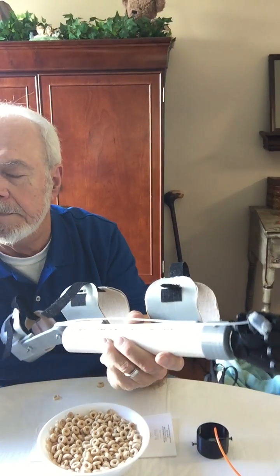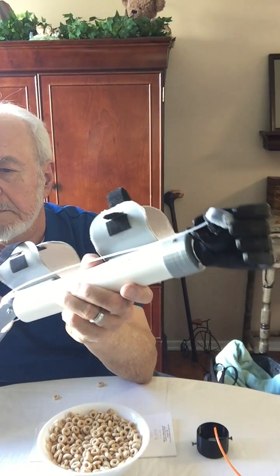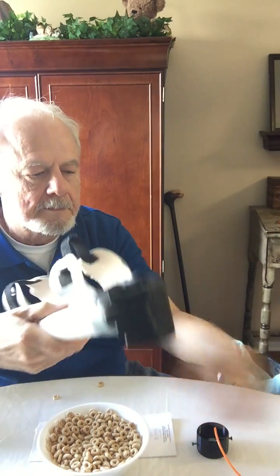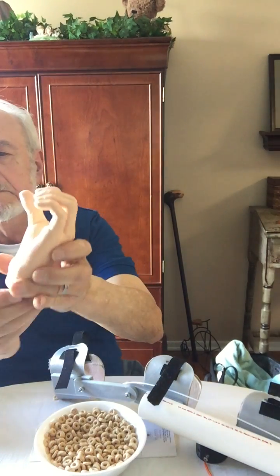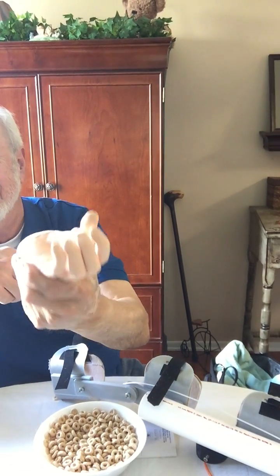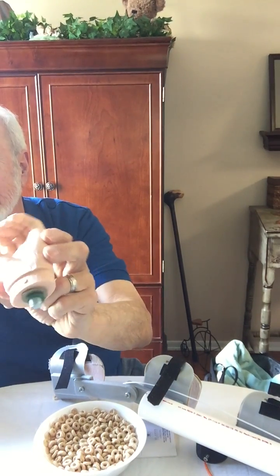I would like to point out that, of course, what you're showing here is an active device, but if you're doing something for a particular sport, it can be a passive device, in which case the terminal device would just screw on to the end. You don't have to worry as much about the Bowden cable. Yes, indeed. So here's a hand.